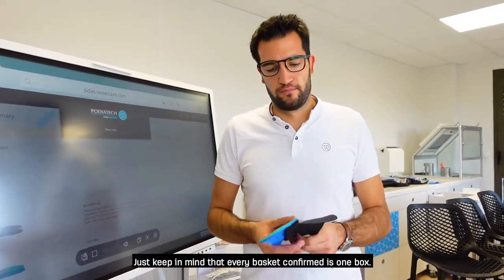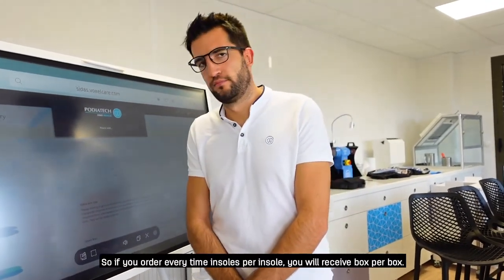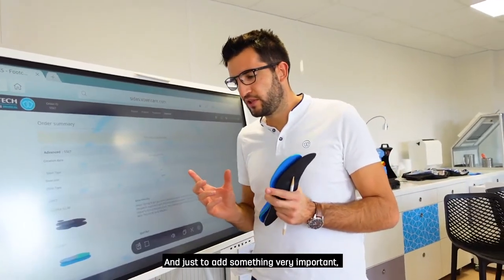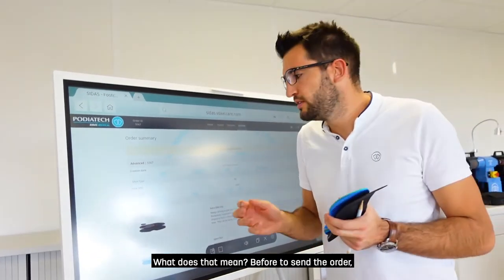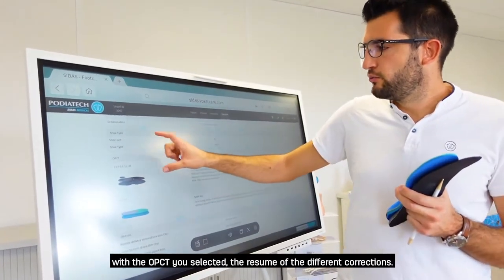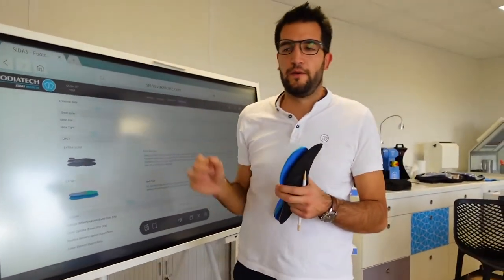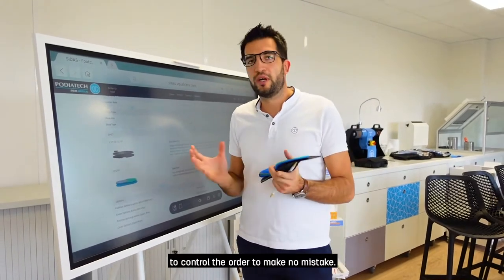Keep in mind that every confirmed basket is one box — so if you order insole pairs one by one you will receive box by box. If you want five pairs shipped at the same time, order them together. There are also multiple control steps before sending — you will see a summary showing the OPCT you selected and the list of corrections added to your insole. Then you validate and it goes to the basket, and then you validate the basket. These steps help you avoid making mistakes.